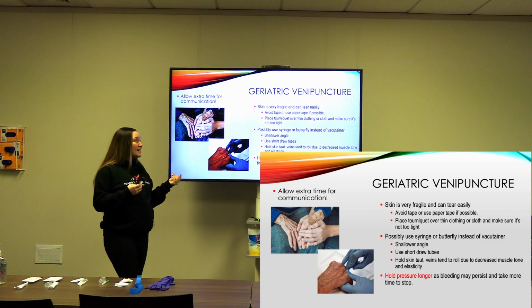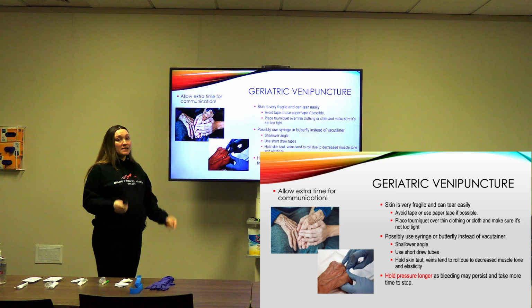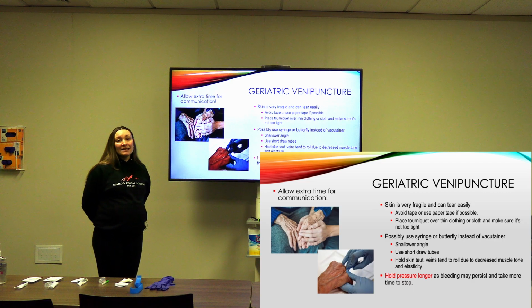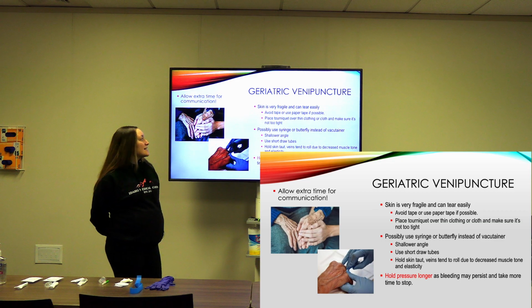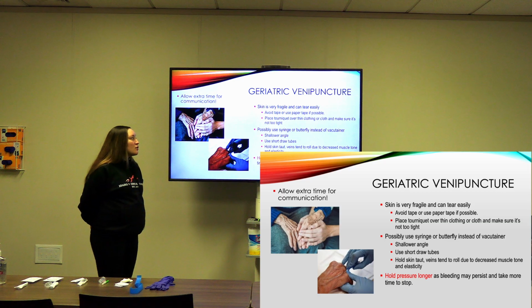Then we are avoiding tape, the plastic kind. We're avoiding tape if we can, just because it can be pretty rough on their skin. If you have paper tape, use that instead. Place the tourniquet over thin clothing or cloth.